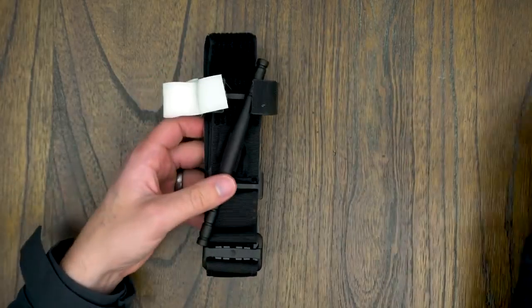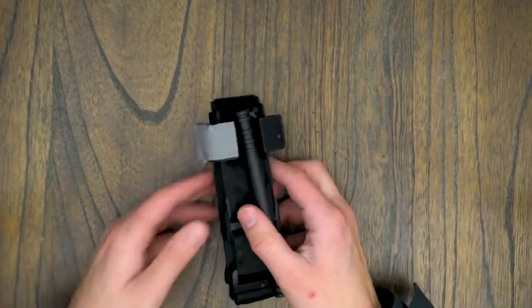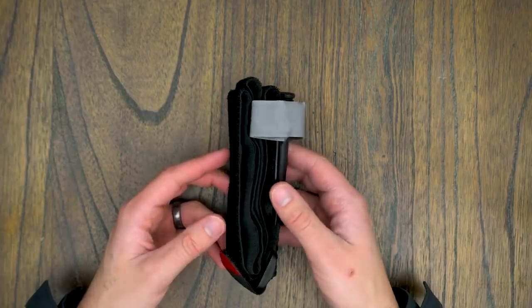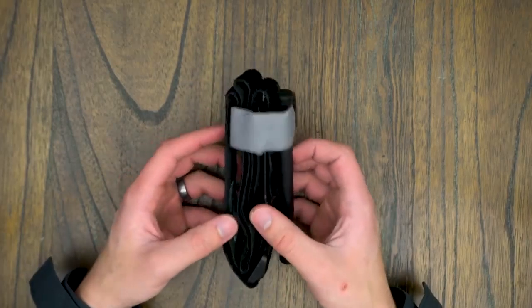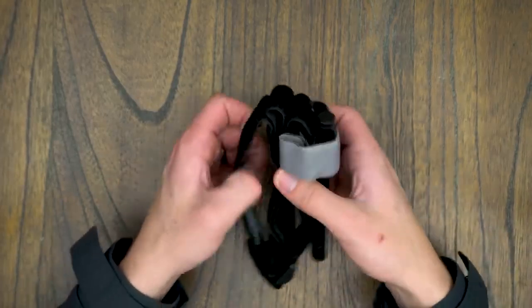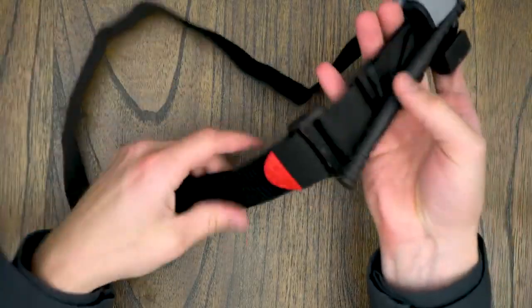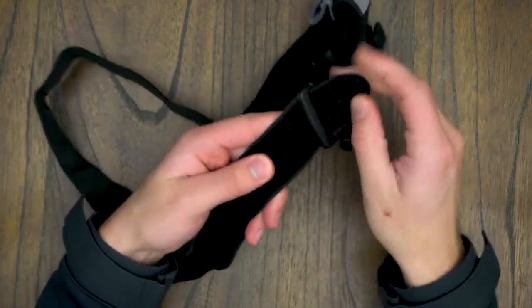Now, one of my friends who is a 68 Whiskey for an infantry unit, he taught me this method, and this is how he was taught to fold CAT tourniquets, and there are some very specific reasons for it. So right off the bat, it looks pretty similar. The front is staged identically. But when you come to the back and you open it up, you actually have two loops inside of there, and this is barely attached to the tourniquet.